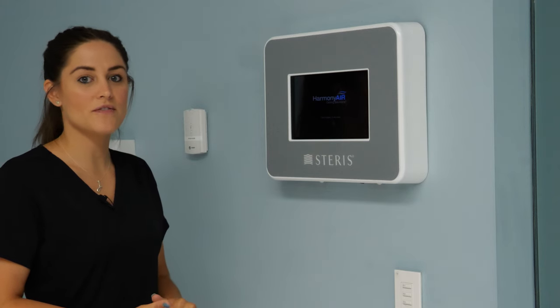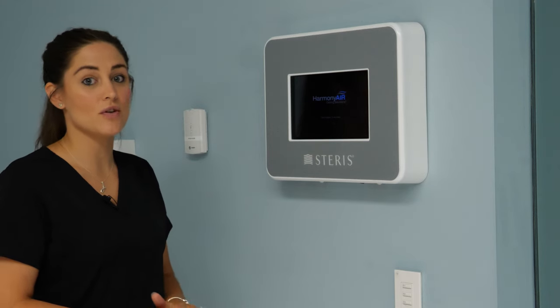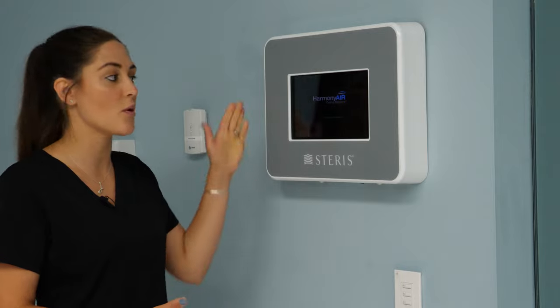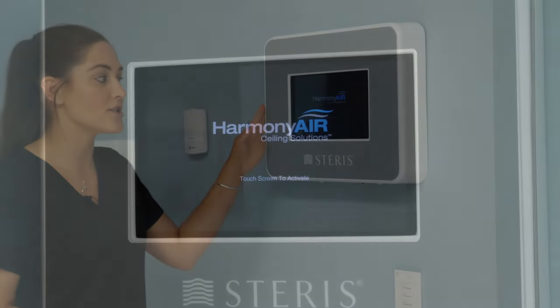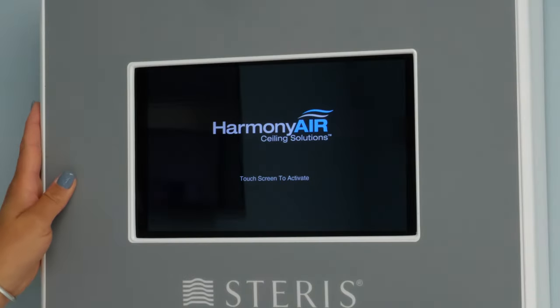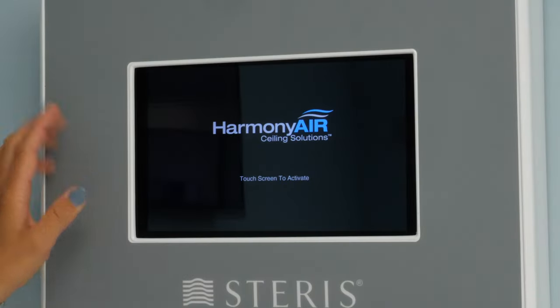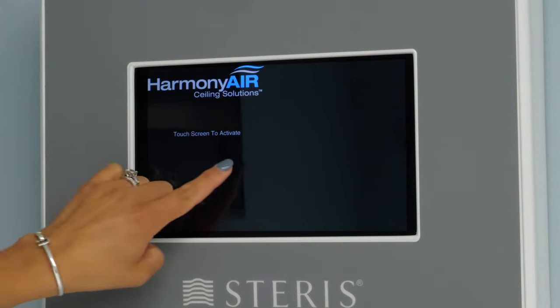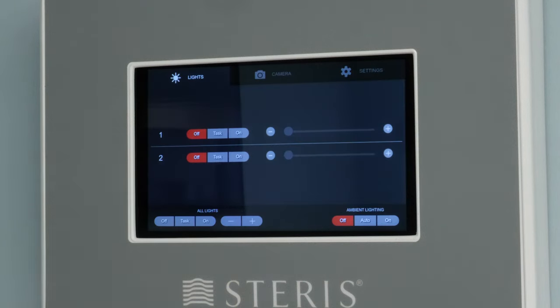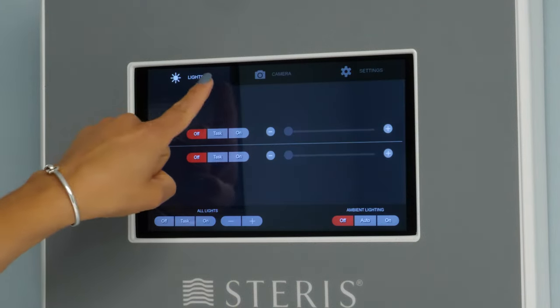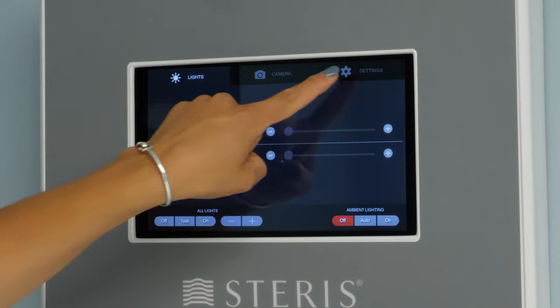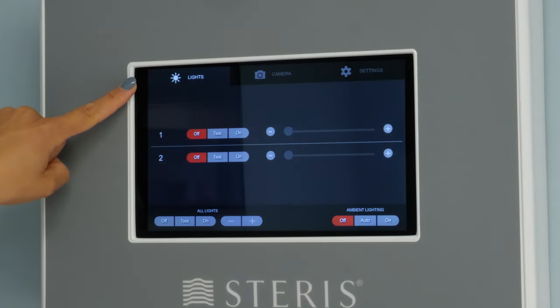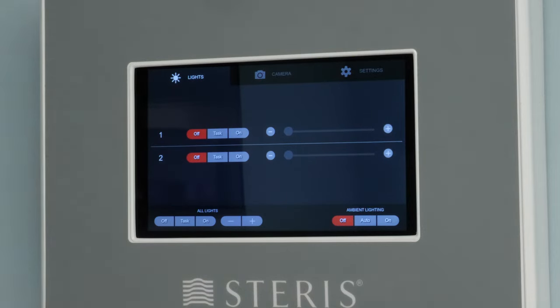There are multiple different ways to control the Steris lights. The first one we're going to review is from the wall control you see here. As you'll notice, it's in standby mode. To activate the screen you just hit anywhere on the screen. There are three different tabs across the top. The first tab is our lighting tab. On here you have two lights listed.